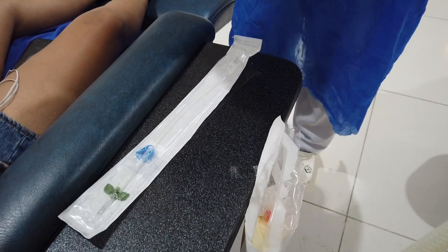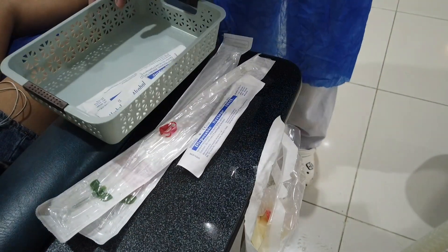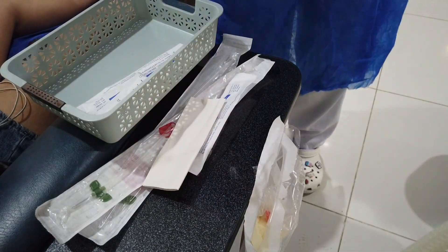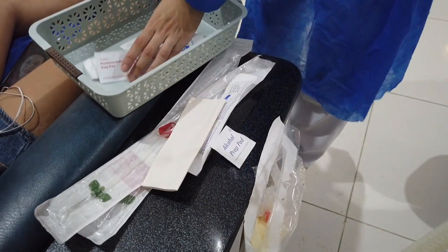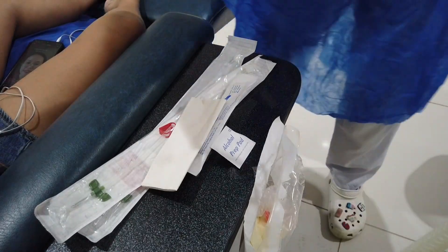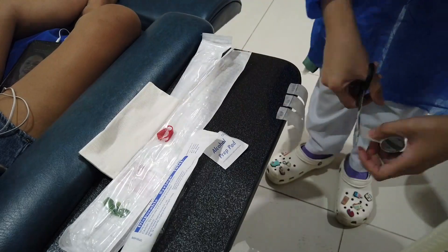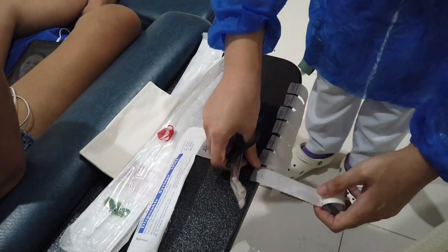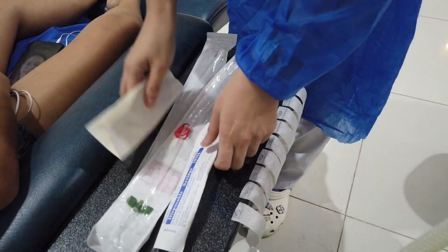First, prepare the materials: venous and arterial fistula needle, syringe for heparin, under pad, alcohol or betadine swabs, and of course, plaster. I pre-cut tapes around nine pieces — six to tape both sides, two to anchor both catheter tubing, and one piece for the dangling bloodlines.